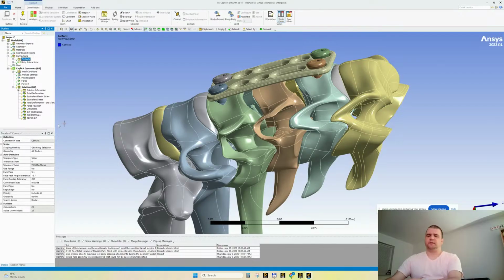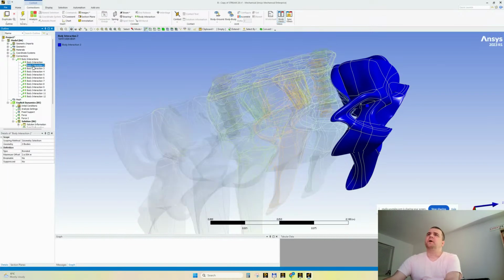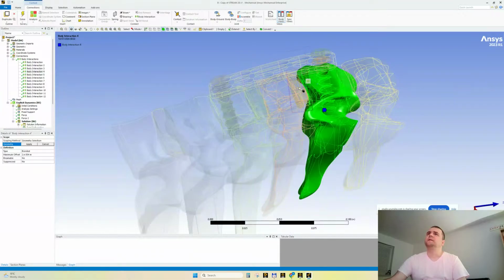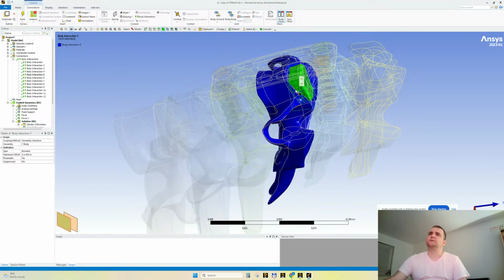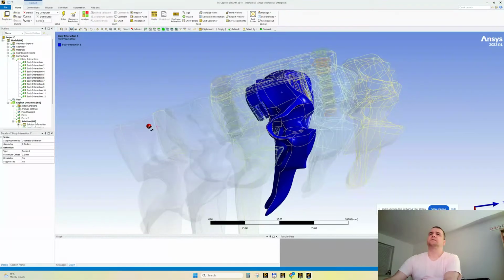So we need to delete all the contacts, and for this specific body interaction, we need to include this cage. And for the next body interaction, we also need to include the cage. And this is it. Let's switch the units to millimeters. And so on, yes.